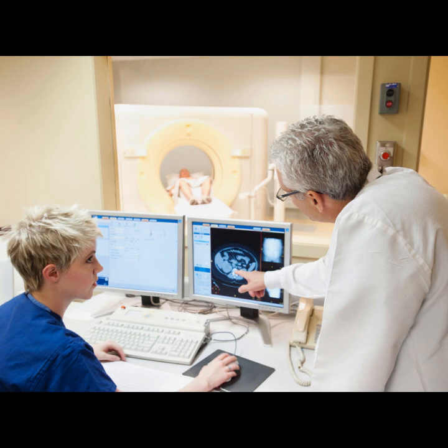How can we trust a dynamically learned path that might be pushing the hardware right to its absolute physical limits? Well, we eliminate that risk by making the optimization physics-informed from the start. When we train the neural network, or whatever optimization framework we're using, to find the optimal trajectory, we explicitly condition it on the real-world MRI hardware constraints. We enforce that the traversal velocity is limited by the maximum gradient amplitude, Gmax, and that the acceleration, which dictates the slew rate, is limited by the maximum slew rate, Smax. The result is a physically feasible, hardware-friendly waveform.